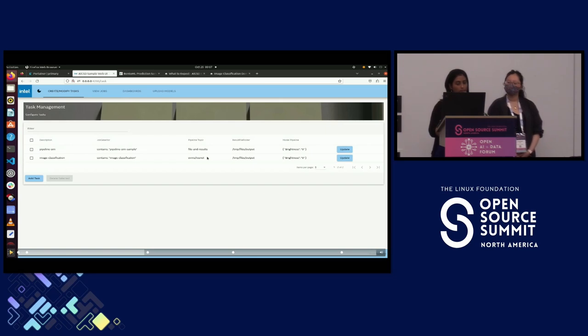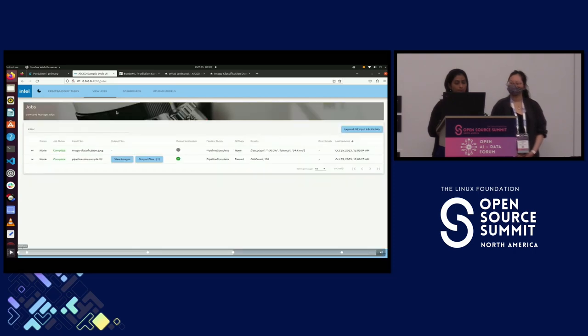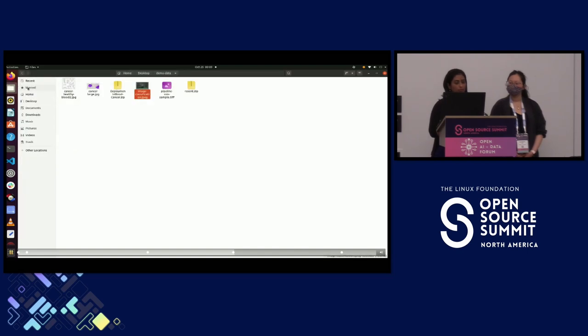So the next piece I want to go through is if you're building your model on your own, how do you integrate that into the system, right? If I have a model that I have generated, how do I integrate that easily into the system? So for that purpose, we are using a cancer detection model, and that model was basically generated using the Intel tool called Geti.